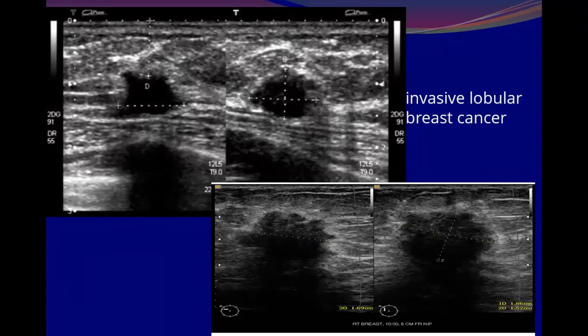Regarding the focal zone, the grayscale, dynamic range optimization, TGC, which one is more optimal? The upper one.